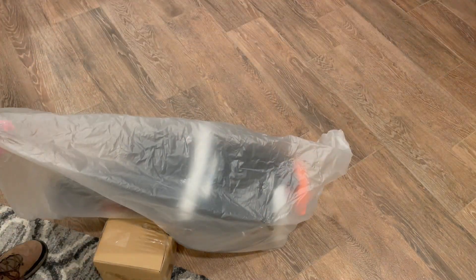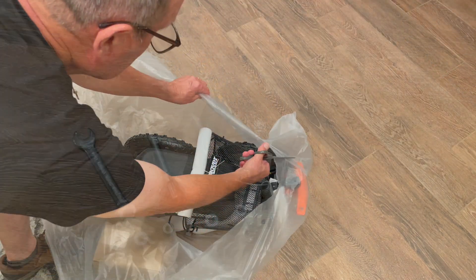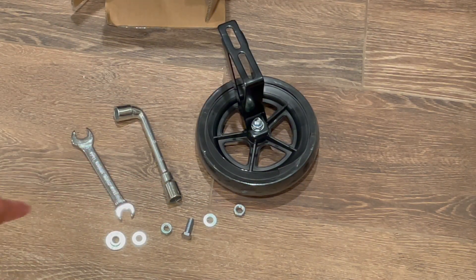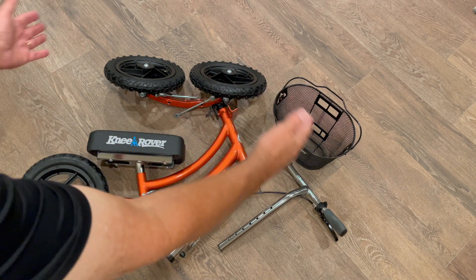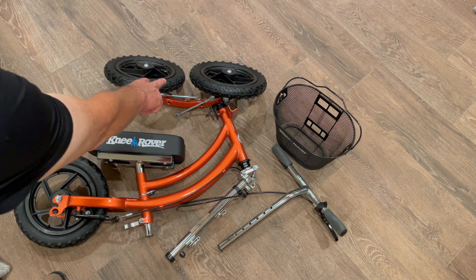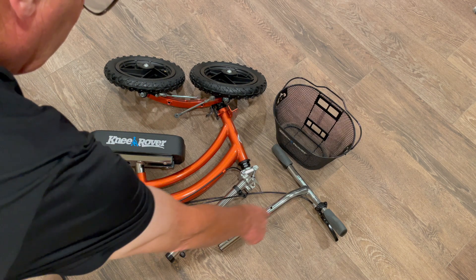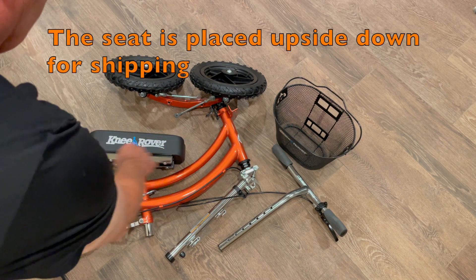It looks like it's packaged well. There's a whole lot of zip ties you need to cut loose, and when you cut them all loose, you'll find a box inside that has this fourth wheel — a training wheel, if you will — and that wheel helps you keep balance if you struggle with it. Here's all the parts that came out of the box: handlebars, a couple of wheels for the back or front, a gooseneck that the handlebars go into, and a basket.